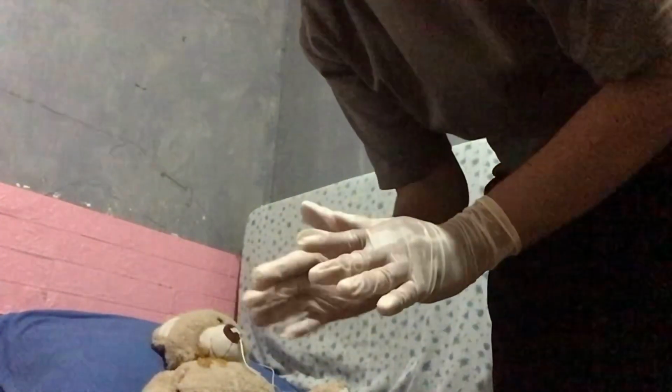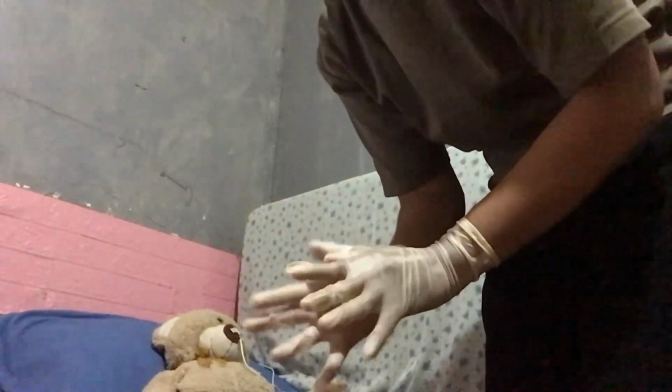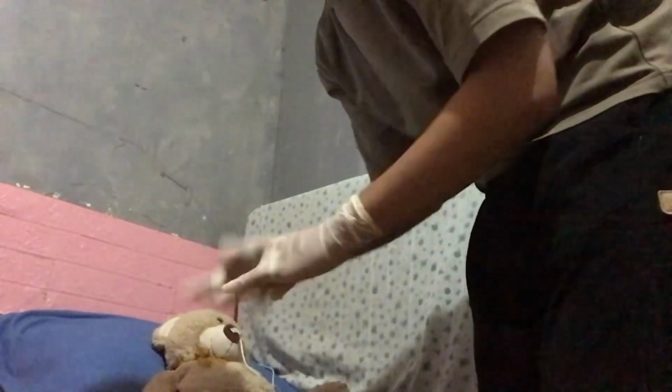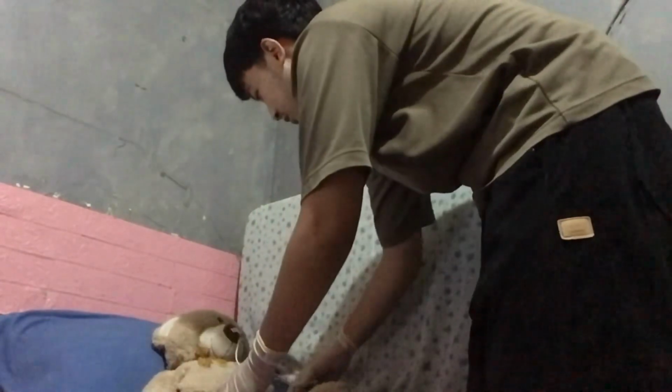Now, assess comfort. Ensure the patient is comfortable and not experiencing any distress. And lastly, document the procedure, including the size, length, inserted method of verification, and patient's tolerance. Sir, okay ka lang dyan? Sir.